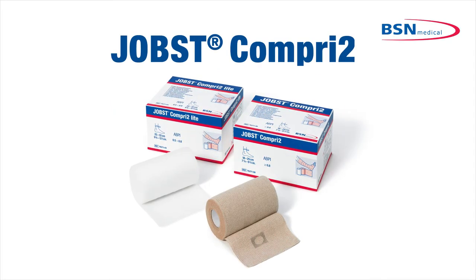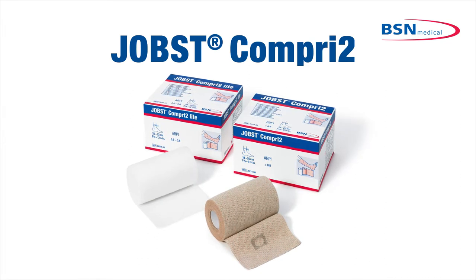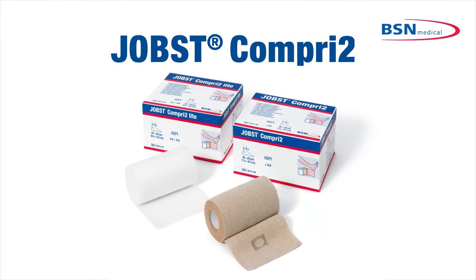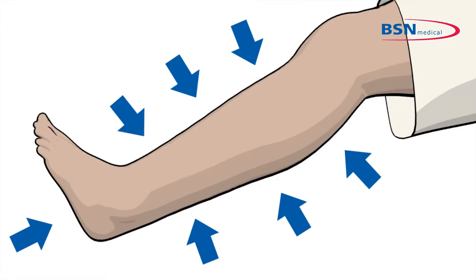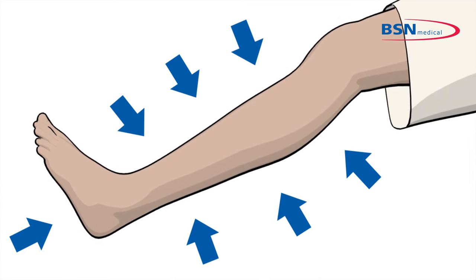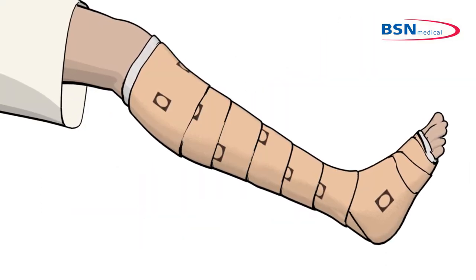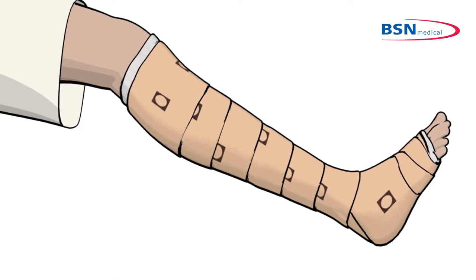This video demonstrates the correct application of the Jobst Comprie II two-layer compression bandage. Through proper application, the compression therapeutically necessary to reduce the edema can be achieved. Please note there are also other techniques used clinically that can provide the desired therapeutic benefits.